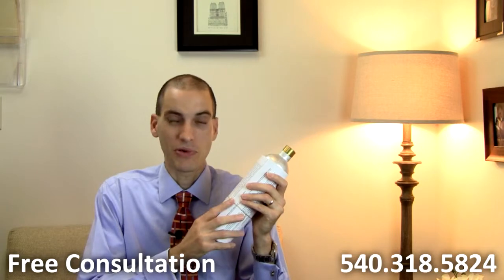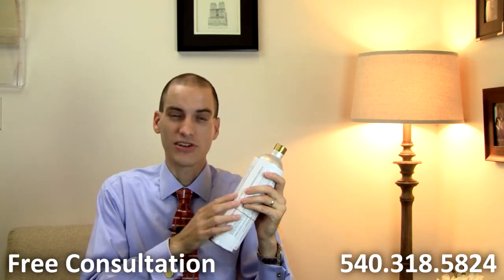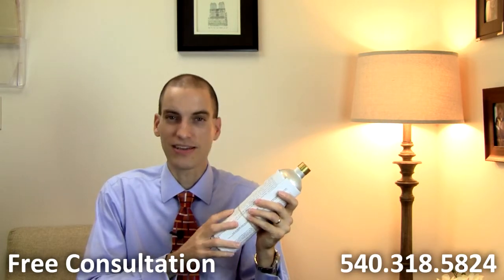Well, what does that mean? Essentially, if a police department has dry gas cylinders on hand and they don't use them enough, or they order too many and they expire, they shouldn't be used anymore, because there's an expiration date on these cylinders, and that means that after that point, it should not be used. It's only been certified up until that expiration date. And of course the other issue is, were the cylinders certified to begin with? This one in particular is. It's certified to contain only 0.08% alcohol, no more, no less.